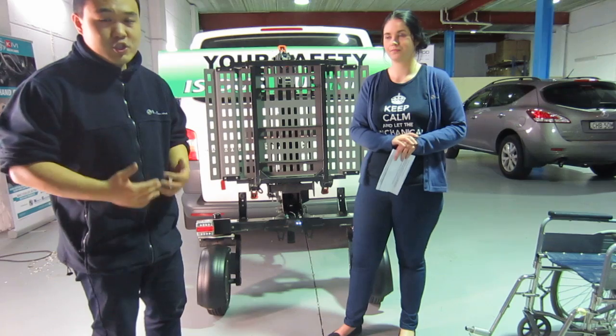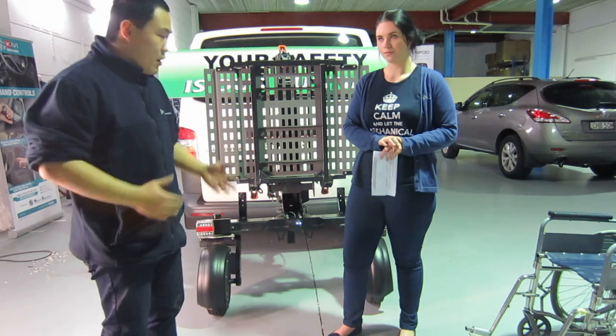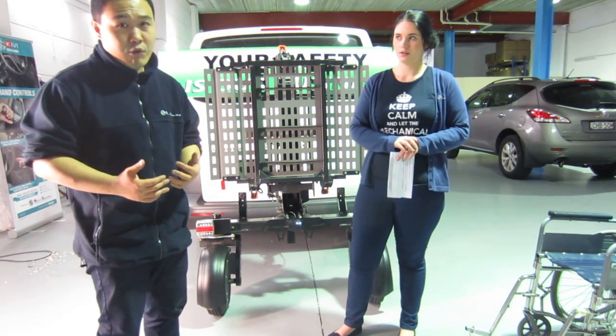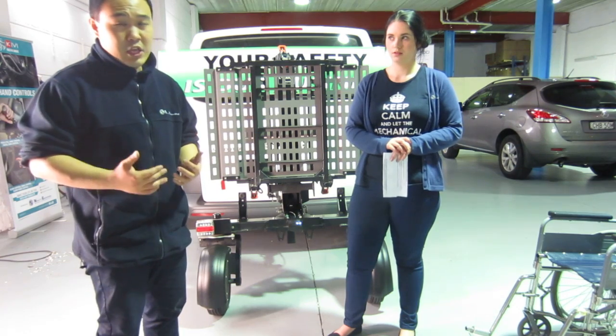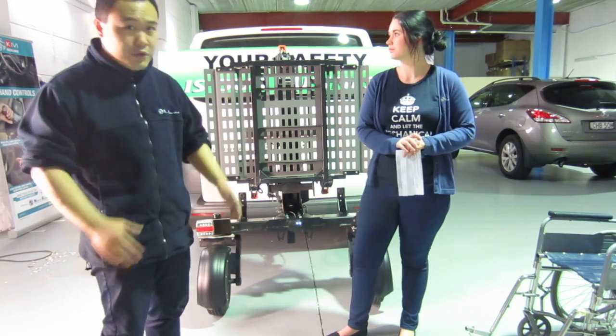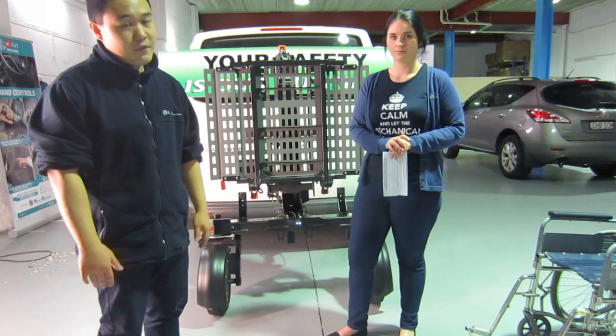The Chariot is a trailer platform which will adapt to almost all vehicles. It is used to carry heavy wheelchairs or scooters without any heavy lifting. Pretty much all you have to do is put the wheelchair onto the platform, hit a button, and let the Chariot do all the heavy lifting for you.